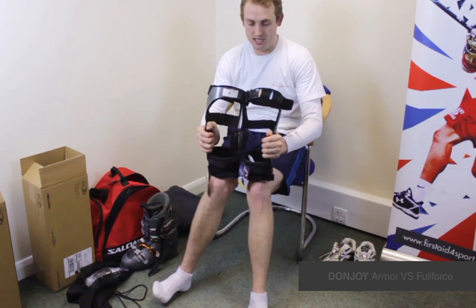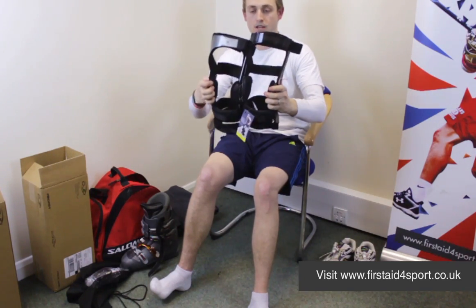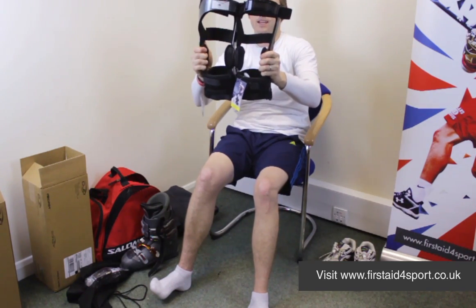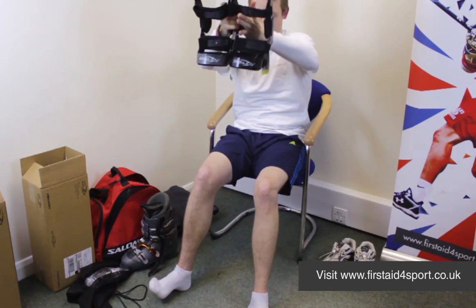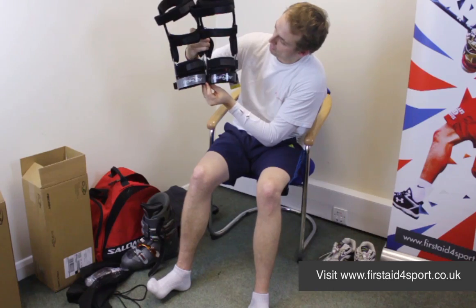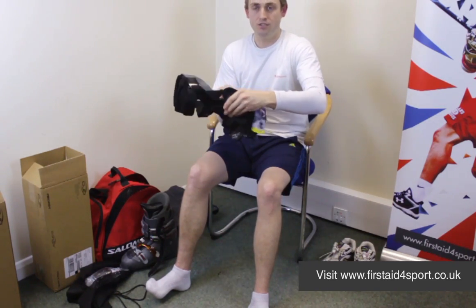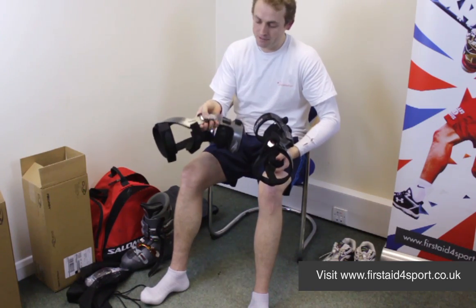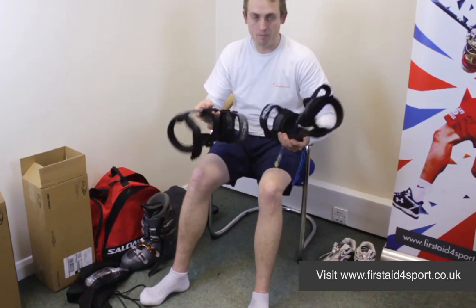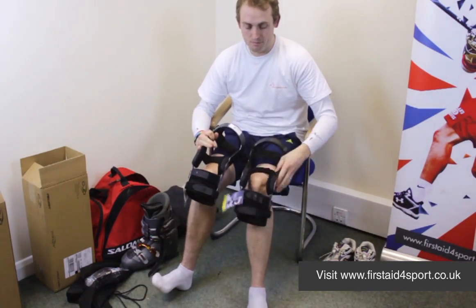As you can see with them side by side, the braces are pretty much exactly the same size. They've got the same length calf, they've got the same force point hinge. The only difference is the Armour's got a little bit of bling and they've chromed it up, but other than that, mechanically, the braces are the same.